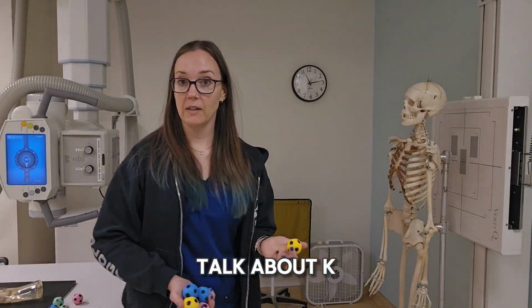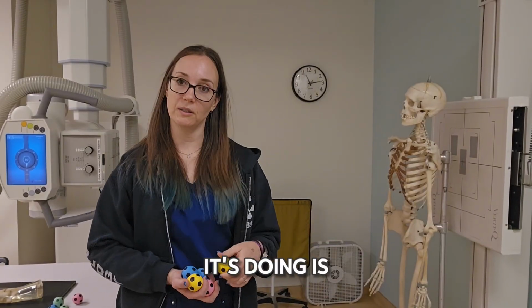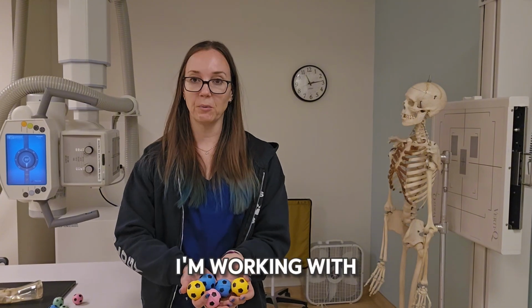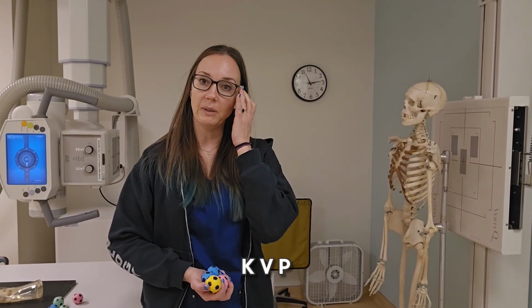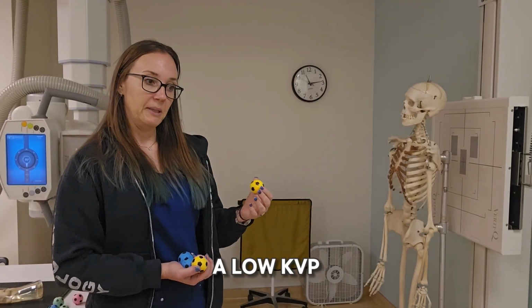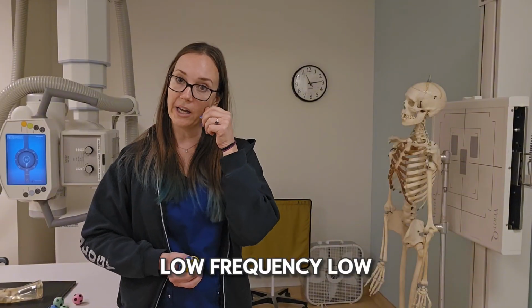So when we talk about kVp, kVp controls the quantity and quality, but mostly what it's doing is controlling the quality. So if I have a low kVp, and let's say I'm working with 5 mAs, okay? I've got my 5 balls, and I'm going to use a low kVp, let's say like 50 kVp. When you use a low kVp, it means it's going to have a very long wavelength, low frequency, low energy.